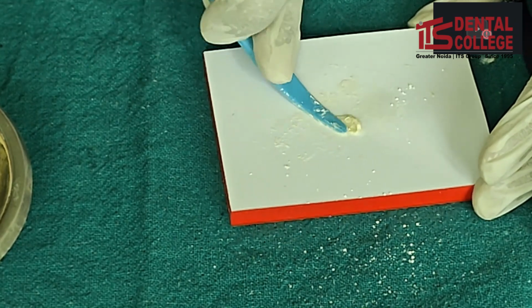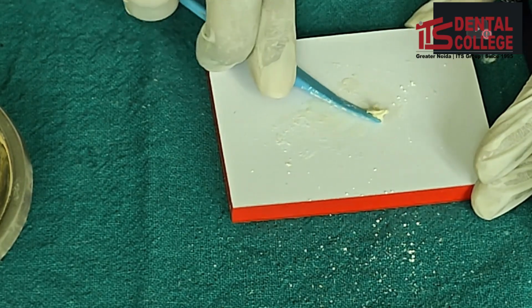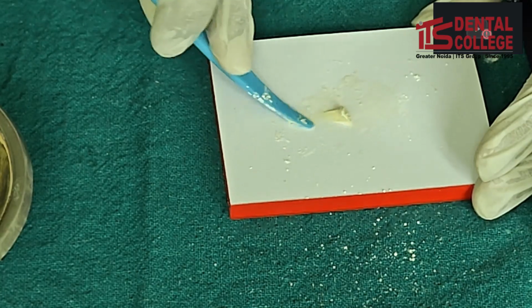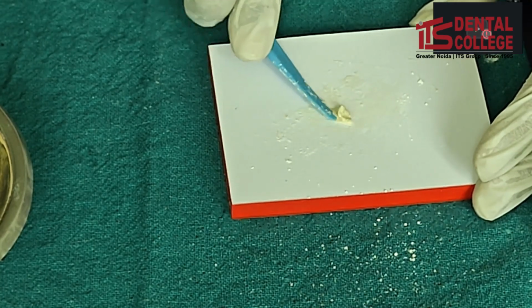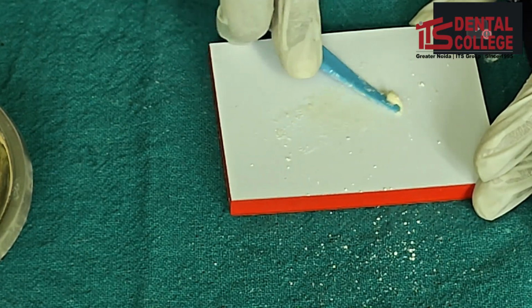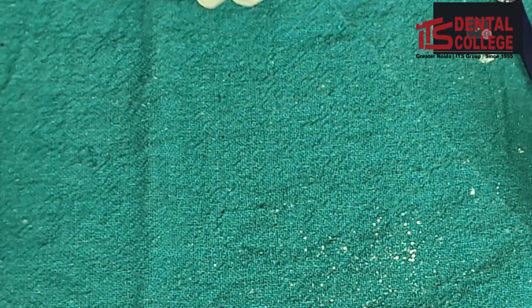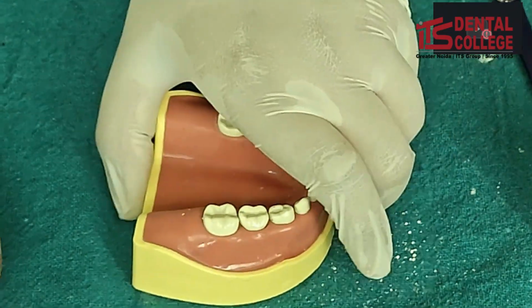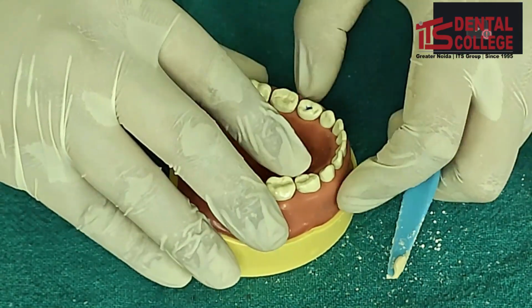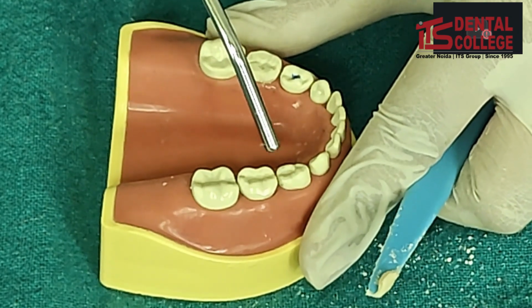So we have to swipe and fold the mix in order to get a proper glossy surface of the final mix. The final mix should be viscous and in a packable consistency. Restoring the cavity with GIC. In order to restore the cavity with GIC, we have to first wash it and then air dry it.